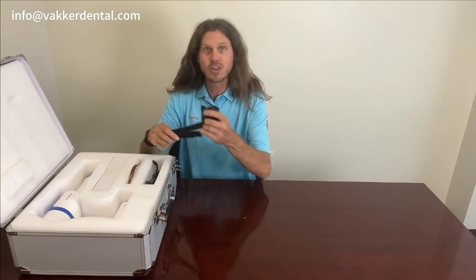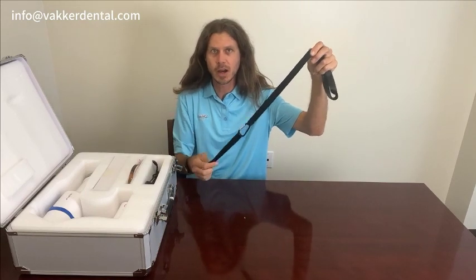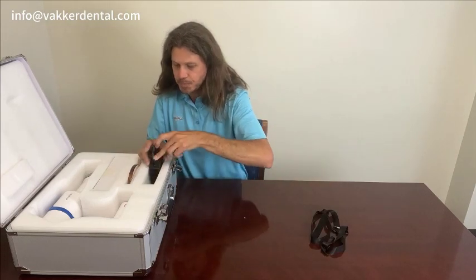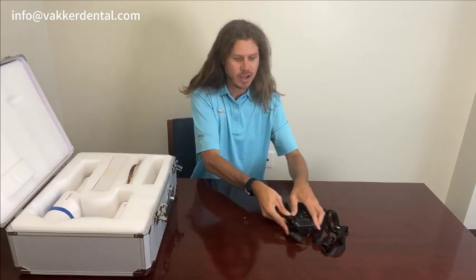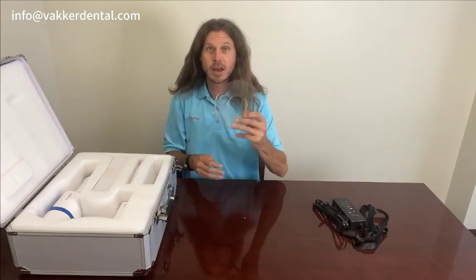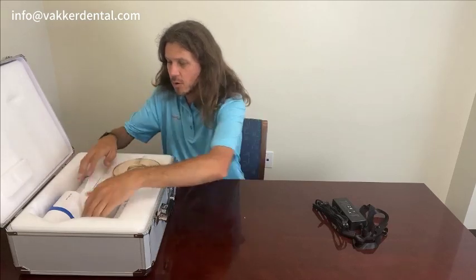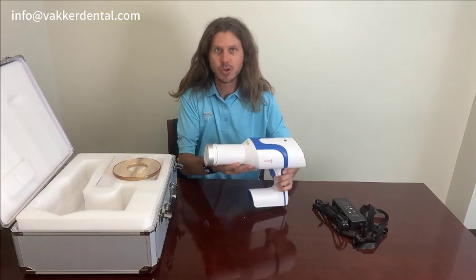We'll just go over a few of the things that come in here. First off, it does come with a neck strap. You will go ahead and attach this to the AI Ray Pro, and then you're able to put this around your neck. It does come with the charger for the unit — I'll show you where that plugs in in a second. It also comes with the x-ray scatter shield, and we'll go ahead and pull this out here and show you how to put it on.